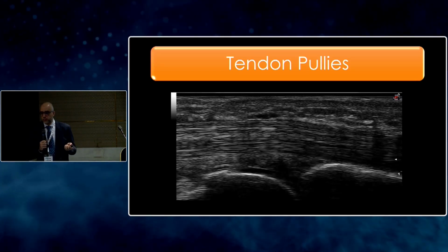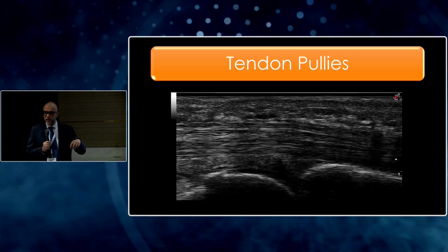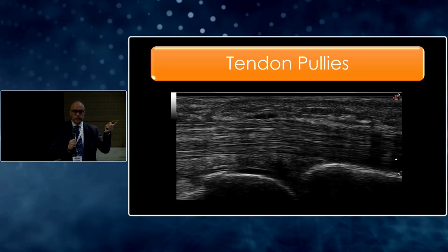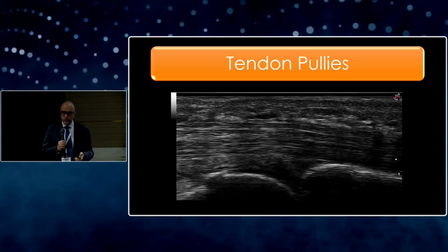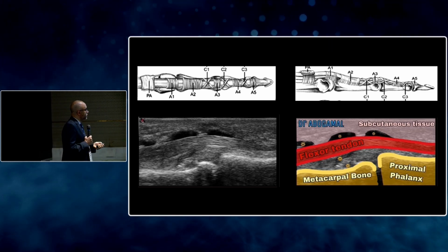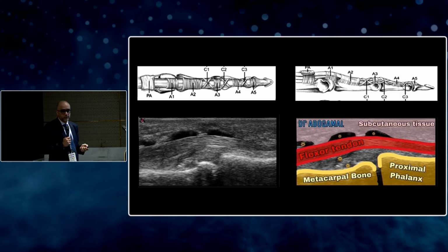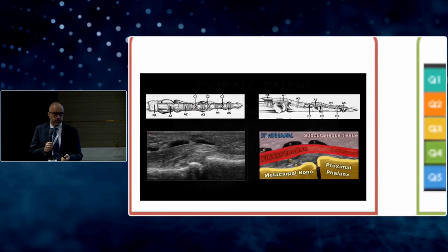Based on the GRAPPA recommendations, the first line of treating dactylitis is local injections. If you are injecting the finger and not knowing exactly where the inflammation is, you can miss the response. If you are injecting the joint while the inflammation is around the pulley, you will miss the response in your patients. That's why ultrasound in dactylitis is important. This is a cartoon representing the image of the sausage finger, showing distension of the pulleys, while the tendon itself and the joint are completely fine. So for inflammation in dactylitis, ultrasound can still play an important role.